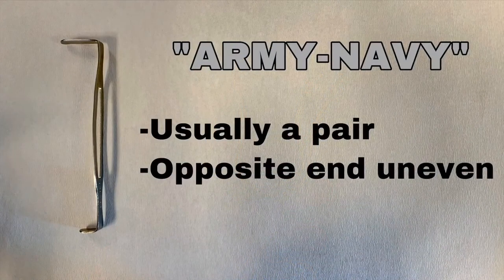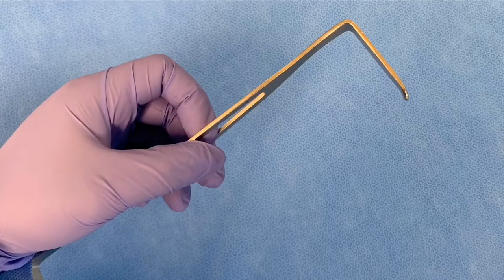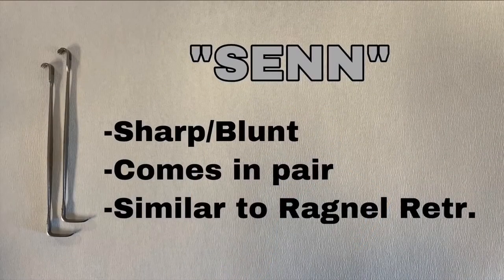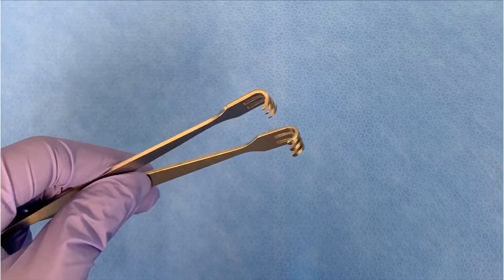This is the Army-Navy retractor. It usually comes in pairs and the opposite end is uneven. This is the Senn retractor, similar to the Ragnell retractor. It comes in sharp or blunt, usually comes in pairs, and the handle can be flat or round.